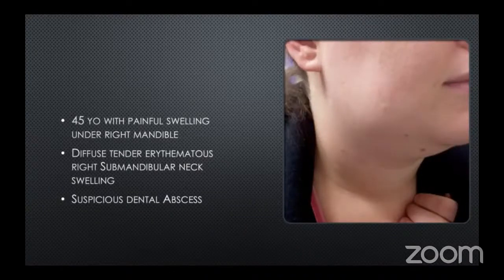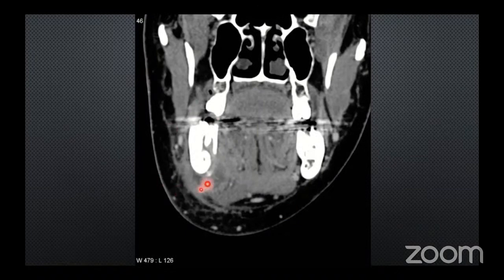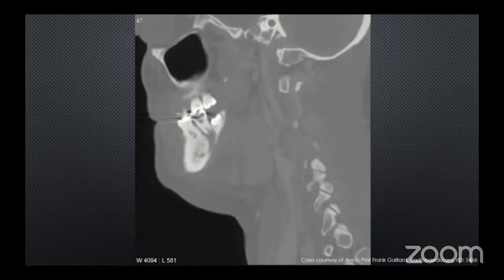Another case of a 45-year-old with painful swelling around the right mandible, diffuse tender erythematous right submandibular neck swelling, and suspicious dental abscesses. As you can see here, there is an obvious periapical lucency extending through the mandible inferiorly into the soft tissues of the submandibular space. And you can see this better here on the bone windows. You can see the cortical bone being breached on the inferior border of the mandible.